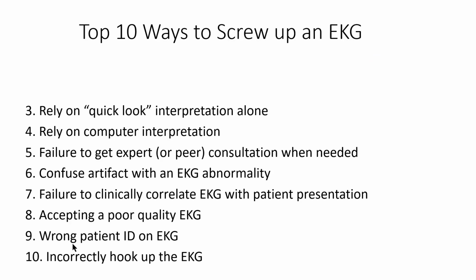Next is relying on quick look interpretation alone. We've said that with time and experience, you're going to be able to just look at an EKG and identify certain abnormalities like ST elevation MIs, and that's going to be a function of ongoing practice. However, experienced clinicians have a tendency to over-rely on the quick look interpretation. More than a few times I've seen the attending physician be given an EKG in the ER, and he looks at it for 3 seconds and says, "I'm unimpressed," and then lays it down. What we want to do is do the quick look, but then go back and with our checklist, make sure that we're hitting all of the important parts so that we don't miss a subtle but significant finding.